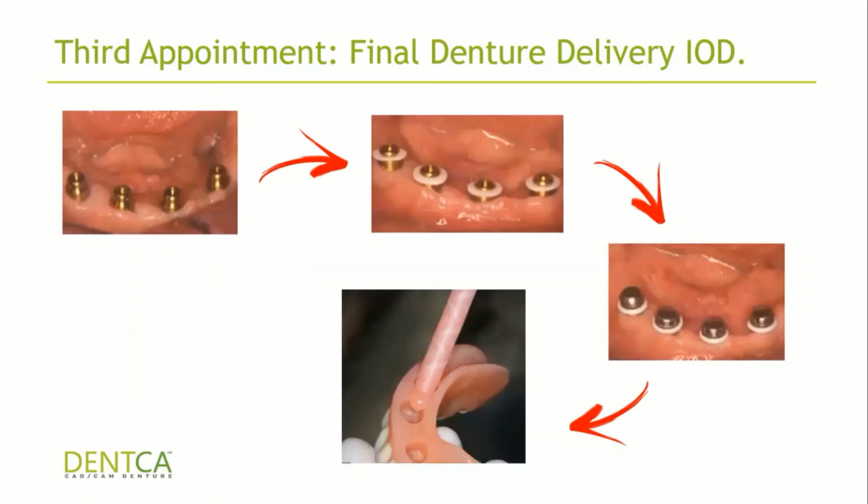Now, if you're doing an implant overdenture, then you have your locators, and then you're going to put the caps on, and you're going to make sure that the IOD sits properly and make sure that you don't need to relieve these holes further. And once you ensure that, then you basically fill these holes with auto-cure acrylic. You're going to seat the denture directly over the patient's mouth, wait for it to polymerize, and then you basically separate it and finish the polishing procedure.